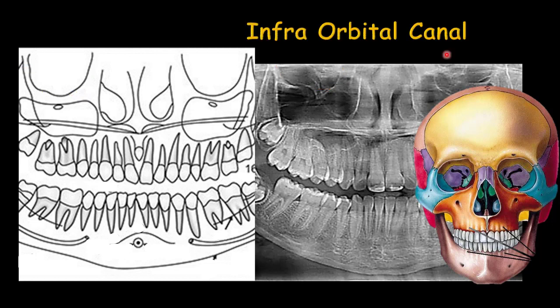The infraorbital canal starts from the inferior wall of the orbit, goes through the inside of the maxillary bone, and comes out from the infraorbital foramen. It can sometimes be detected inside the maxillary sinus.